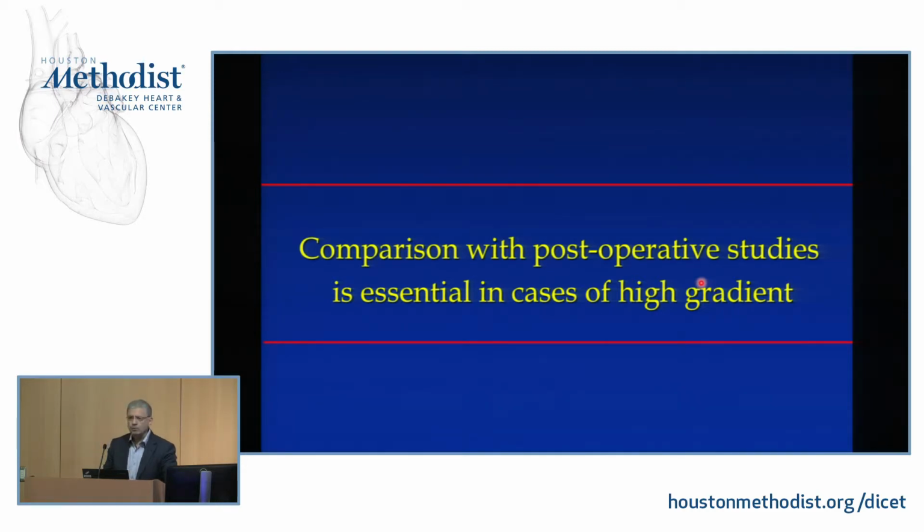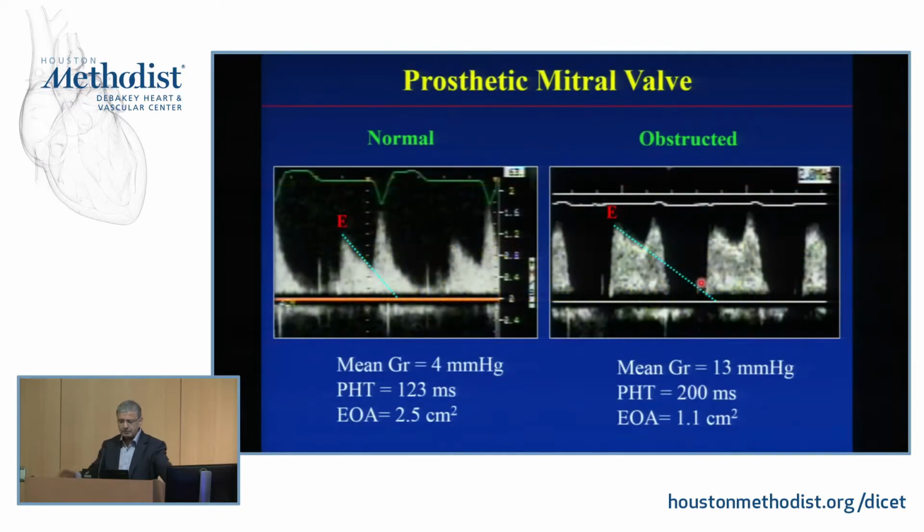So therefore, you're always going to have one before discharge from a hospital, but maybe you want to repeat it down the line, 2 to 3 months, to get a true baseline. However, in that baseline, these velocities and gradients probably are overestimated relative to the true baseline because of the hyperdynamic situation. How about mitral? Mitral is actually a bit less difficult, I would say, than an aortic prosthesis.